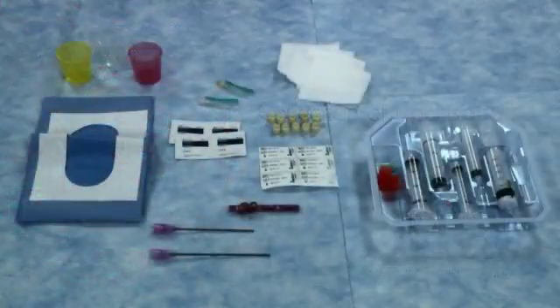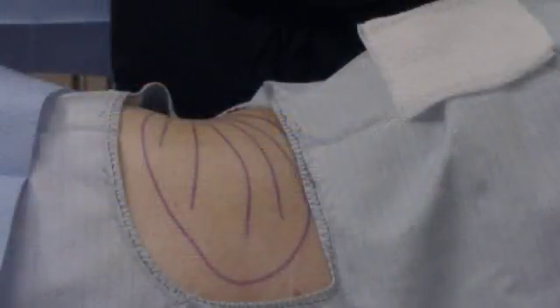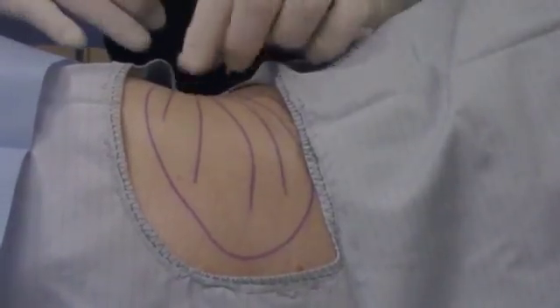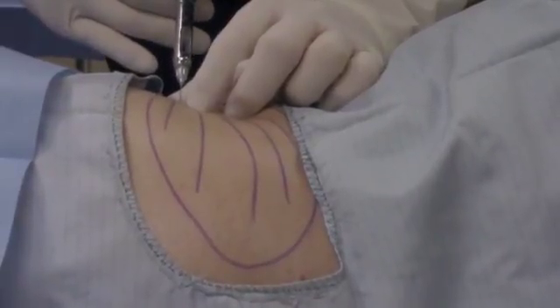Prior to the start of lipoaspirate processing, all contents within the procedure pack should be opened within the sterile field. The donor site should be prepared following sterile and aseptic technique. A sterile drape is provided to isolate the donor site. Anesthetize the donor puncture site with the 25-gauge needle provided.